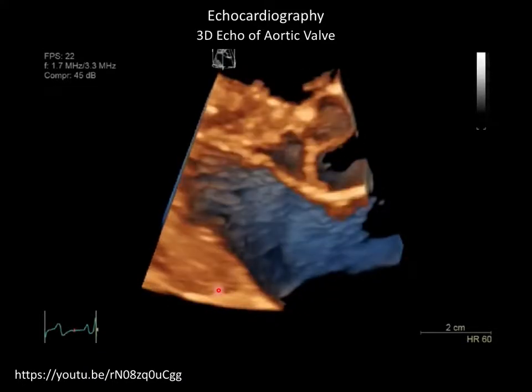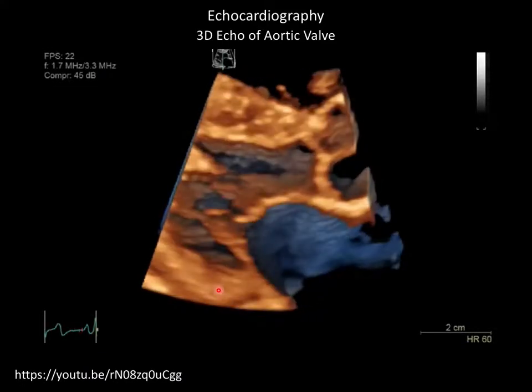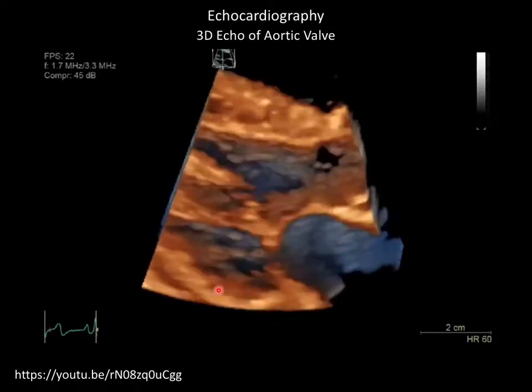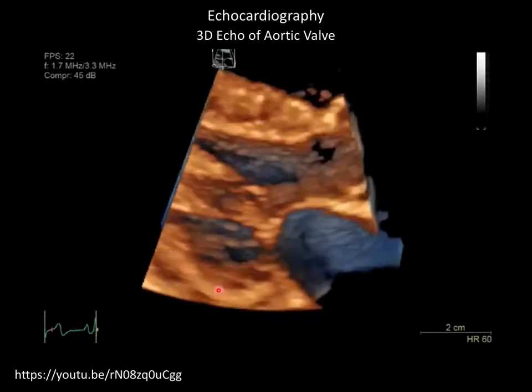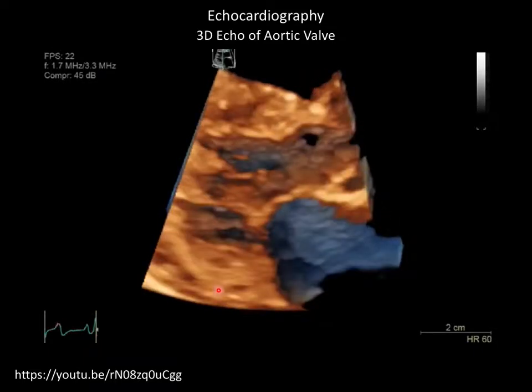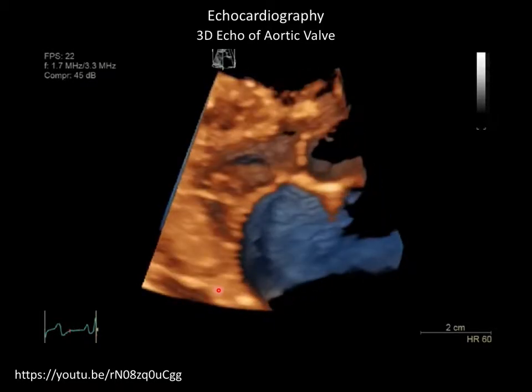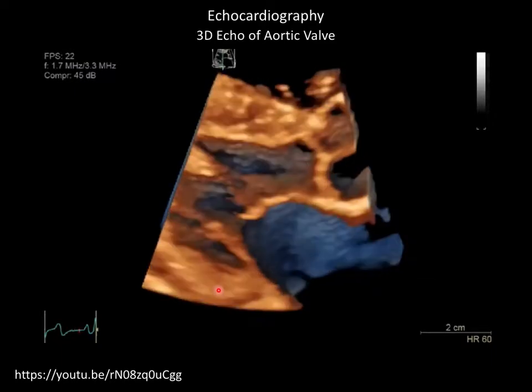So if we're doing 6 frames a second, that's like 150 milliseconds to acquire each frame. So can I, in 150 milliseconds, acquire all the ultrasound data from a single volume? And for some systems, it turns out you cannot.